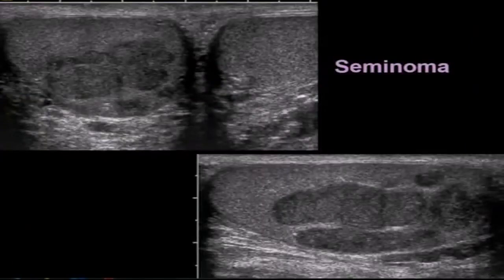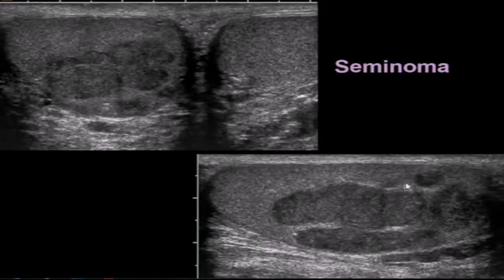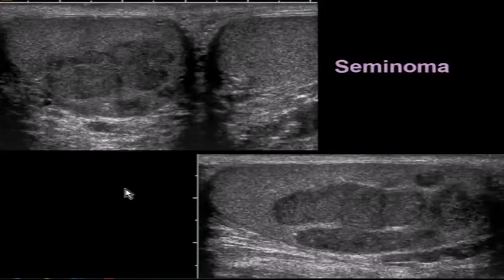Here's a patient who has a right testicular mass. You can see this lobular mass lesion in the posterior aspect of the right testicle. On the longitudinal view, we can see it's in the mid portion as well as the lower pole of the testicle. This mass proved to be a seminoma.